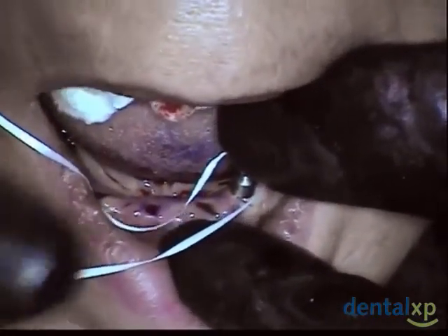If you're freehanding without a surgical guide and don't get the implants exactly parallel, that's where the angle-corrected option is valuable — you can alter the path of insertion. If a patient is paralyzed on one side, they may need an altered path of insertion to remove and reseat the denture. In such cases, I'll go ahead and place angle-corrected ERA implants that allow me, at the time of restoring the patient, to determine the path of insertion best suited for that patient.